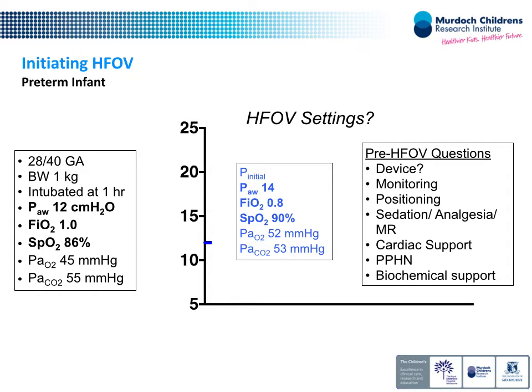And then we did pick 14, and the FiO2 went from 100 to 80%, and our SATs are 90. There was minimal change in our CO2, and there was some change in our PO2. So have we won? No. We're kind of winning, but we haven't really won. This isn't magically better, right? Okay. So then it comes down to where do we pick these numbers from?